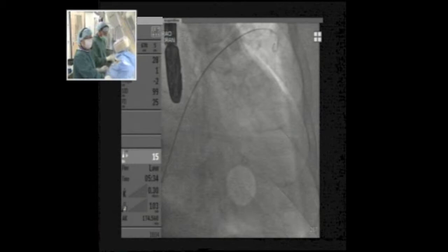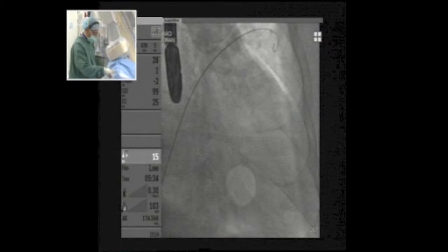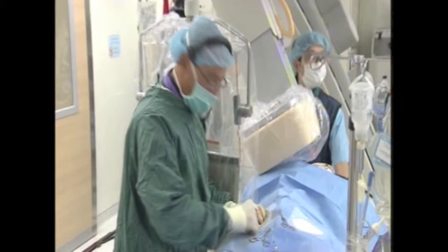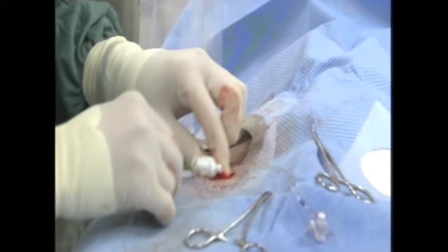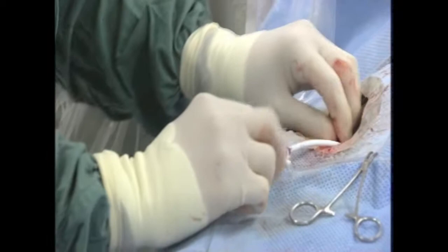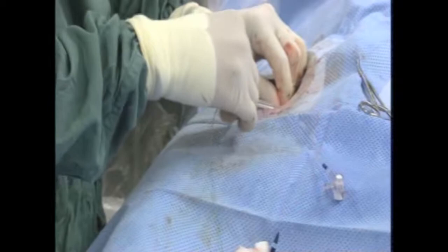We need to open the track in the groin very well. I like to open it with a hemostat, and also pre-dilate with a short sheath before the delivery sheath. The worst thing that can happen at this point is to kink the guide wire in the groin — if that happens, you may need to start from the beginning. We need to load the device first before putting in the sheath.